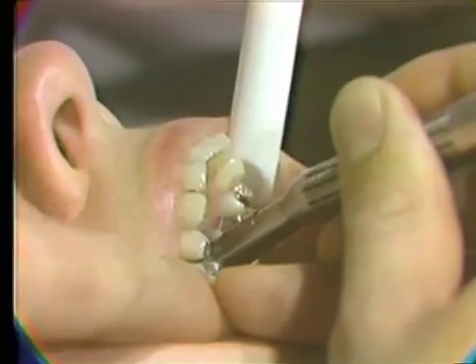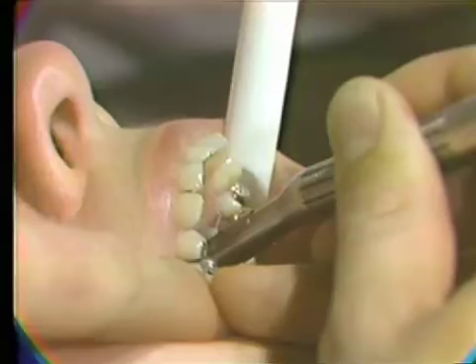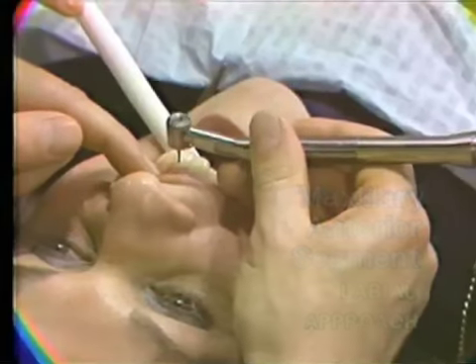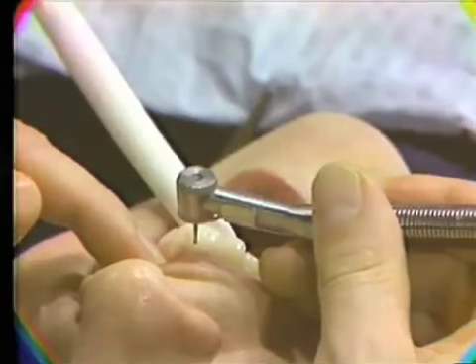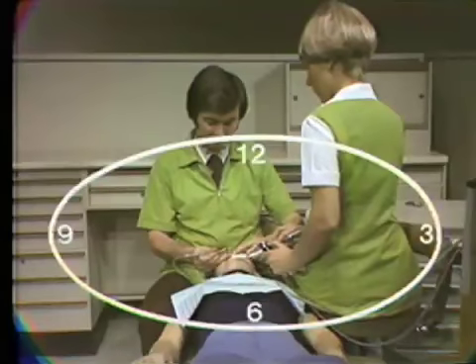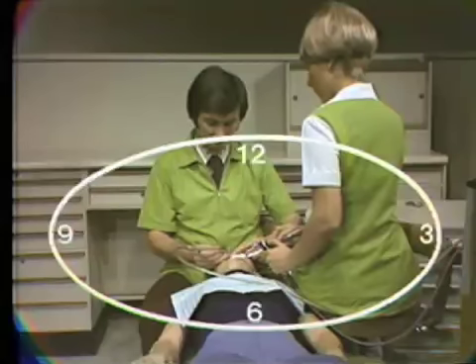Regardless of which approach is required, the maxillary left posterior segment can be treated successfully using the guidelines just presented. The labial approach to the maxillary anterior segment is the most convenient of all the approaches to the oral cavity. Excellent access is available to the operator and direct vision can be used. With the patient supine, the operator can work very comfortably from the 11 or 12 o'clock positions. The patient's head is turned slightly toward the operator as needed to improve access.